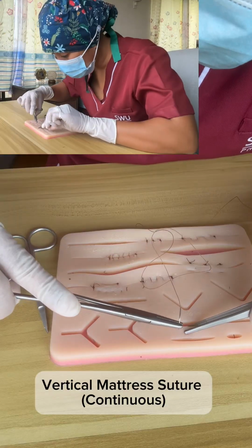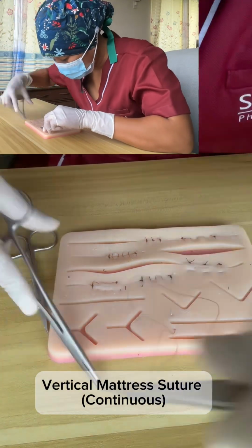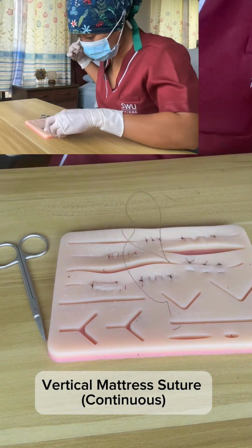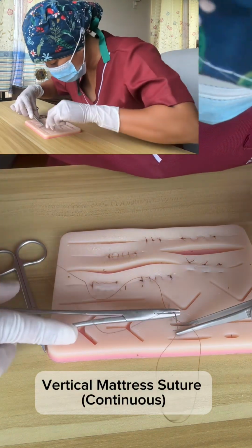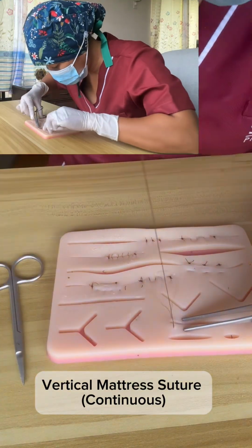The last but not the least is a vertical mattress suture, which I do here in a continuous way. The vertical mattress suture is primarily an appositional pattern, but it often produces slight eversion of wound edges. It is commonly used in skin closure and sometimes fascia or areas with high tension.